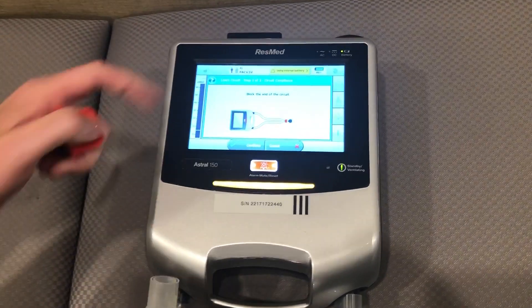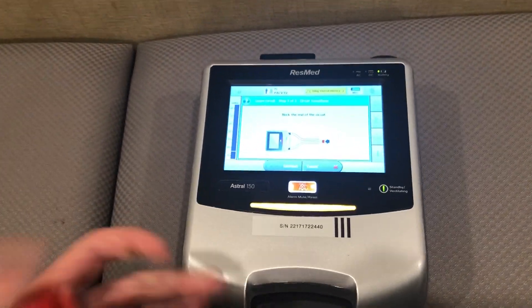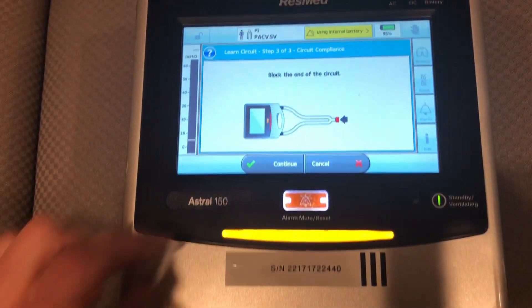Now I want to block the end of this circuit — like so — and then press continue.